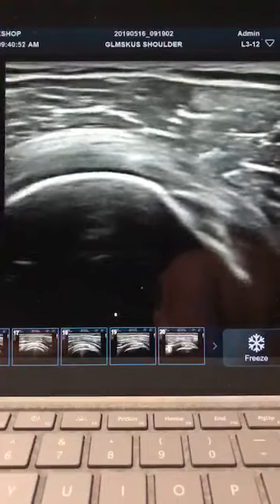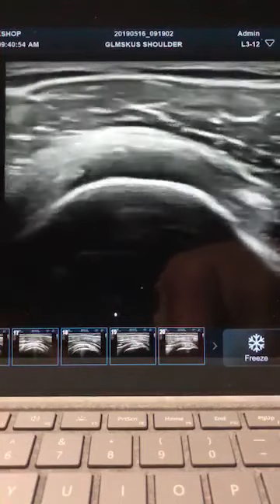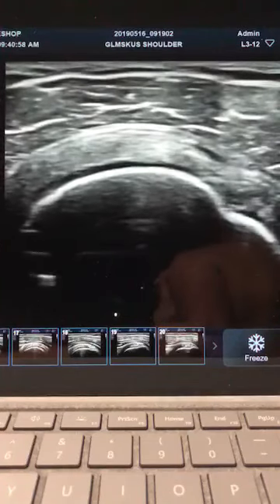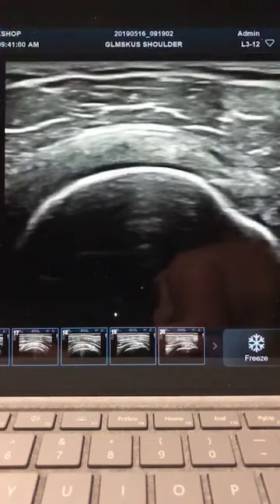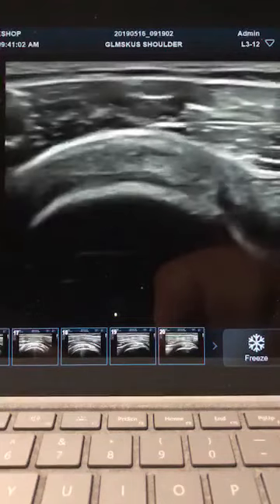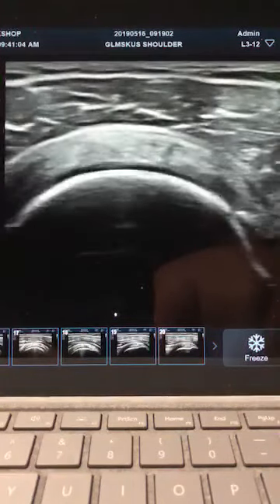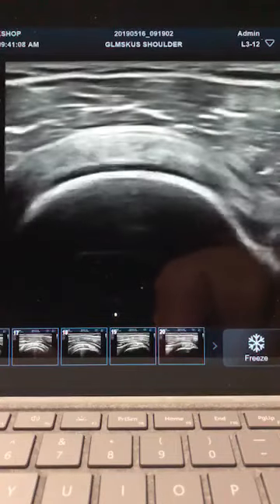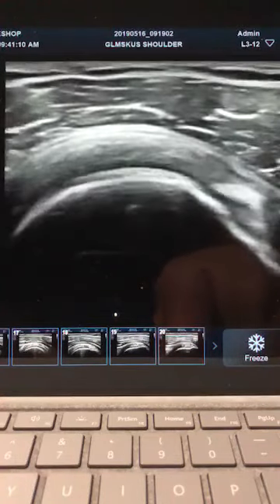Moving the elbow back and forth, pushing the elbow back, will bring that anterior segment out. This will flatten partial thickness tears, but open up a full thickness tear. Bringing the elbow towards you will open up a partial thickness tear, but it may hide a full thickness tear. So be careful when you're looking at that and you suspect a tear.